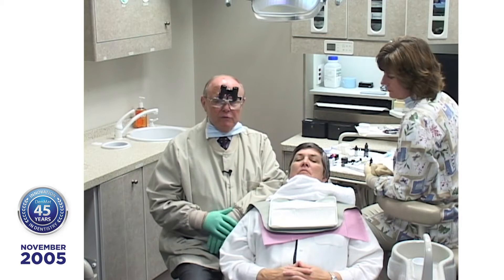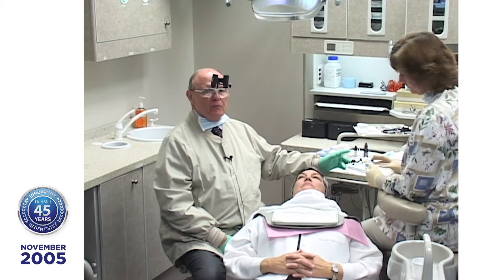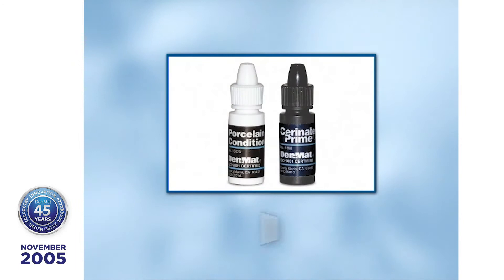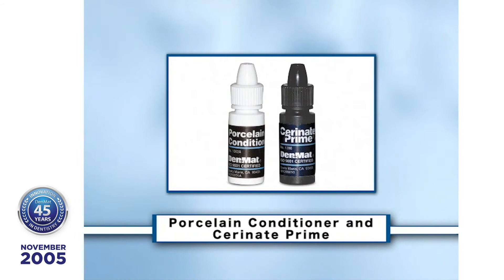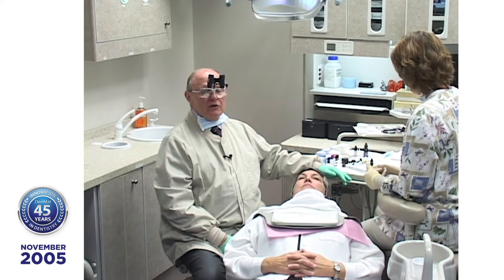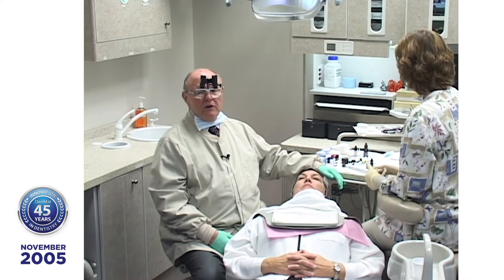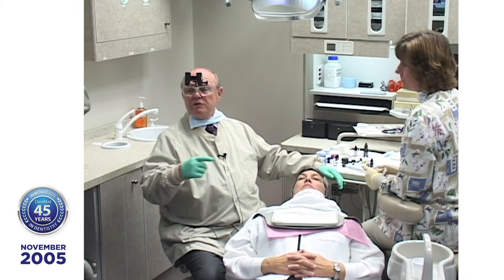Lisa has already put two solutions on the porcelain veneers — the lumineers. She's put on porcelain conditioner, which is an organic acid, and then the Cerinate Prime. The porcelain conditioner activates the Cerinate Prime. When you put that in, it makes your silane the most active it will be. Silanes, once activated, begin to copolymerize with themselves and you get fewer reaction sites. Silane that has been preactivated loses bond strength over time, so you get the freshest, most active silane possible.